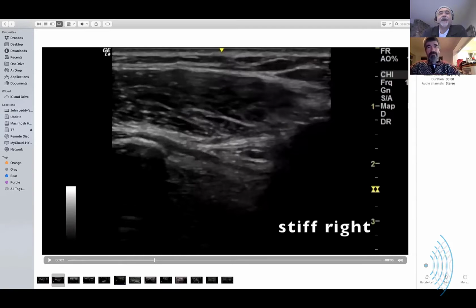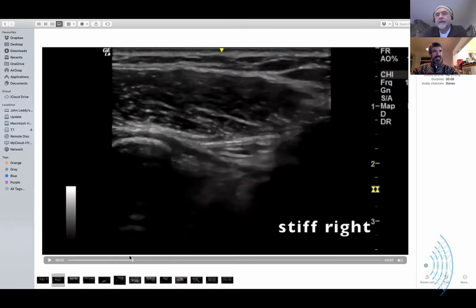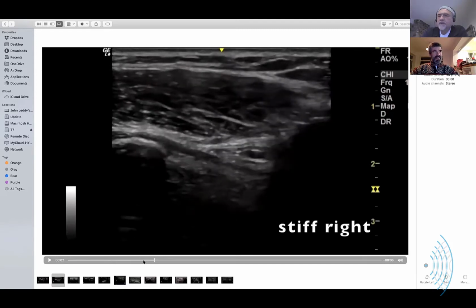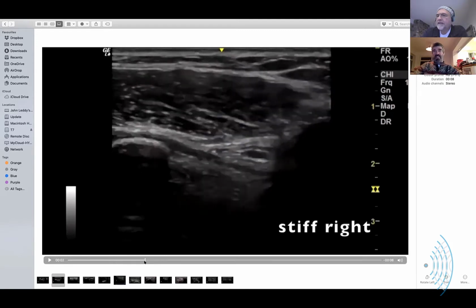I'll tell you what I need. I need a sono hack on this exact spot. So the next time you have the perfect patient, and this would have been one of them, I want to see that. I want to find that. Is that you rotating the humerus? I'm scanning up here at a slightly odd angle. So you don't get a good view of the humerus at this angle. But you get a good view of the coracoid.